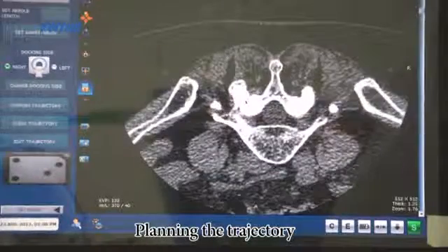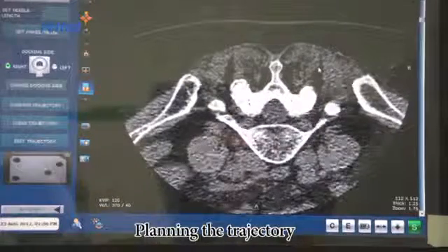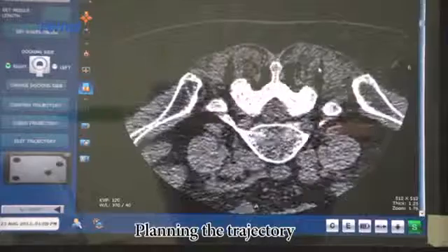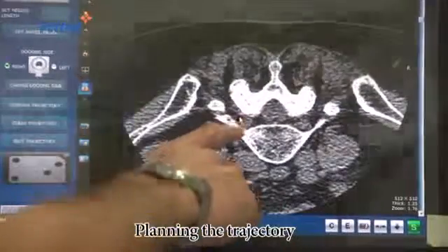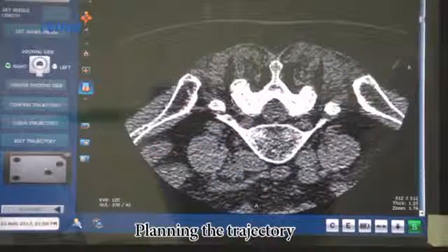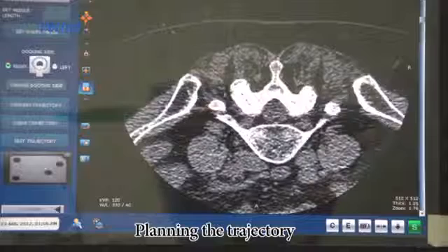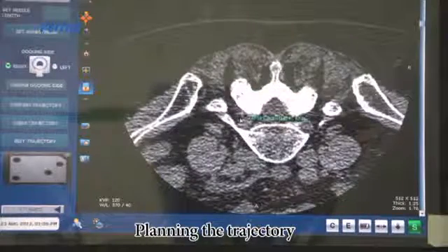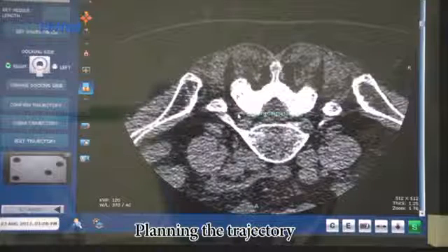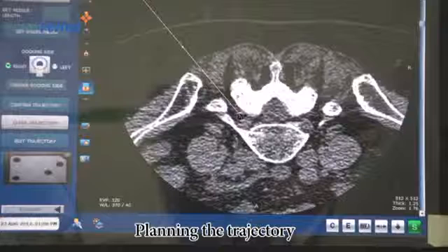Have a little look and see whether there's a better entry point on this study. And actually, this might be a slightly better approach. You can see just down here that there's a nice window to get down. So we're going to select our target point, and I'm just going to have another look. Yeah, I think that's where I would like to finish the needle, and click there.